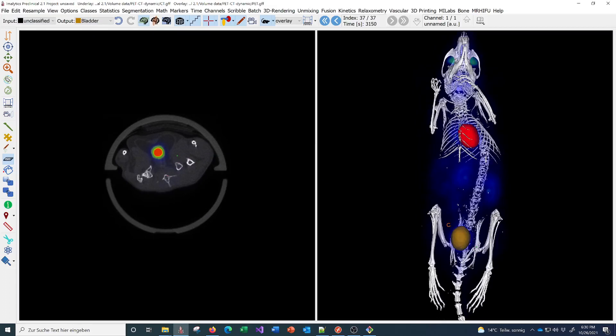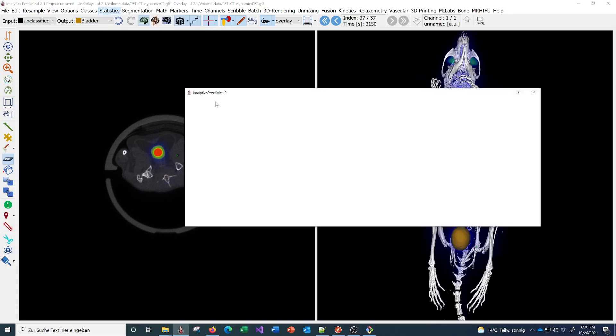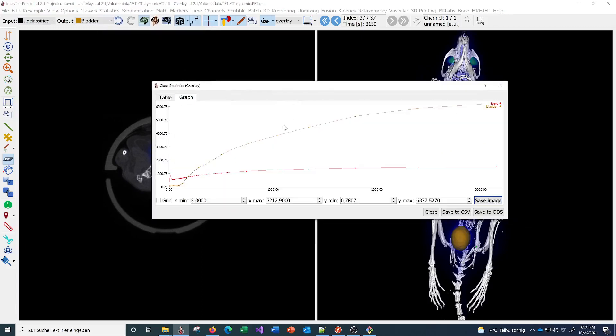Now we can get the statistics as a function of time and show that in a graph. This is a time-activity curve for the heart and the bladder, for example. You can save it to a CSV file.